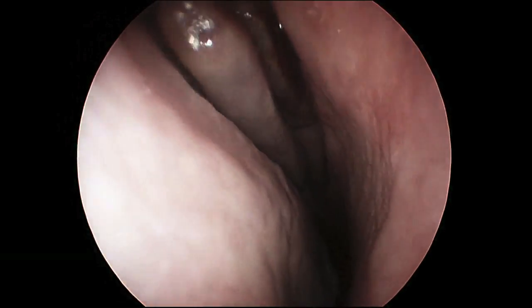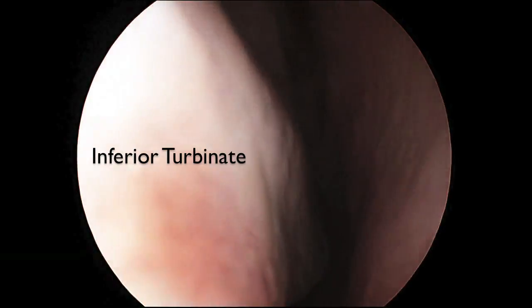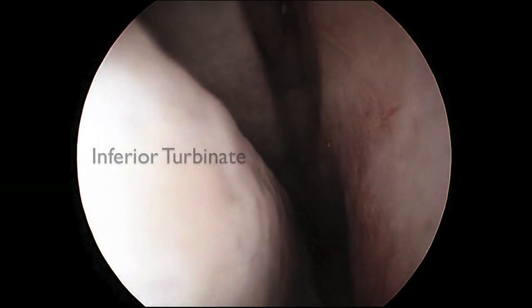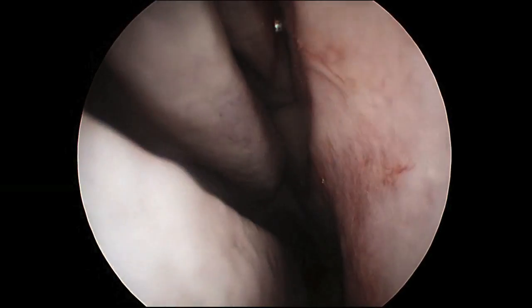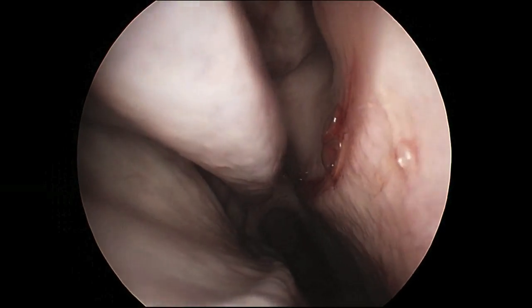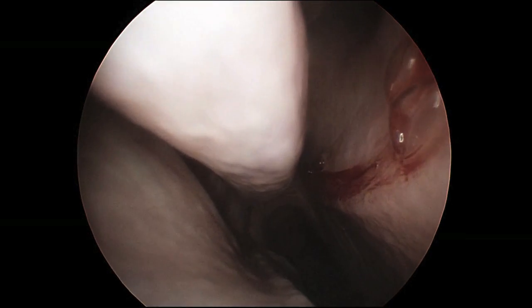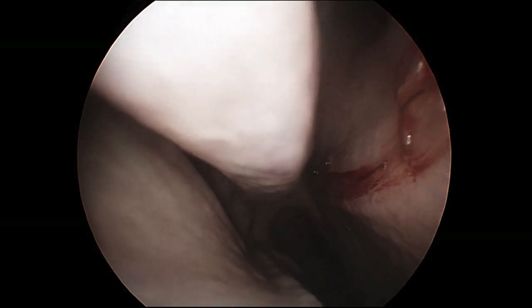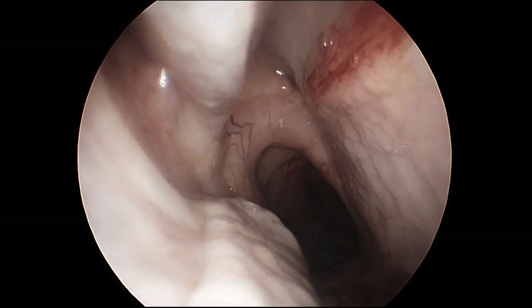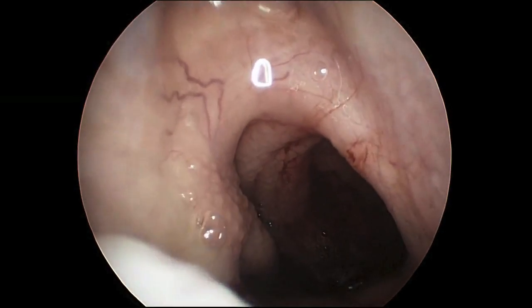On our left you can see the enlarged inferior turbinate, which is quite enlarged, especially considering that we've already placed Afrin decongestant spray in the nose. So normally the turbinate is even more enlarged than this for the patient. And on the right you can see some bloody mucus, which is just from the numbing medicine we've placed in the nose for the upcoming surgery.